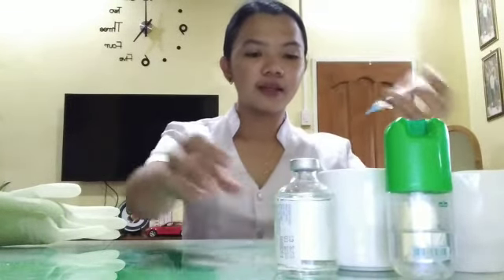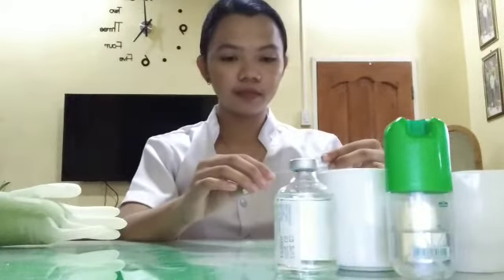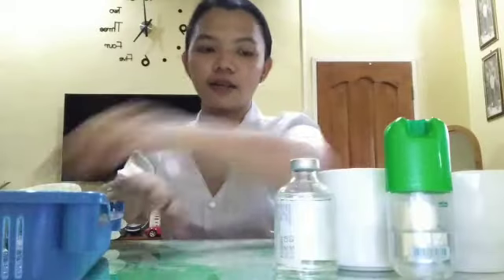Okay, so after that we will put the cap and put it on the tray.